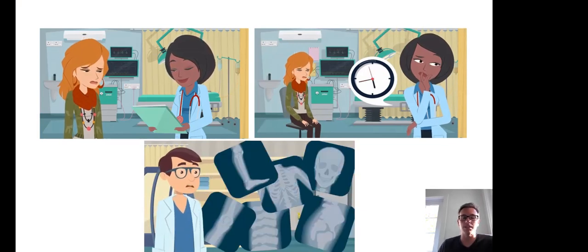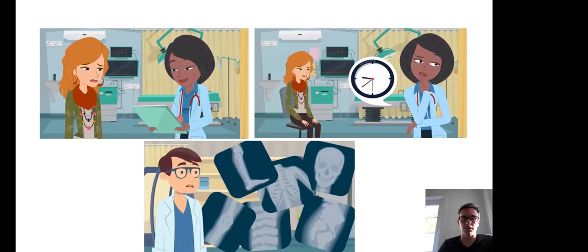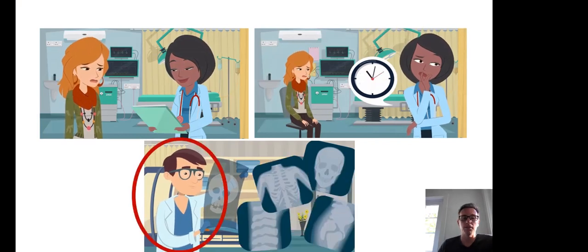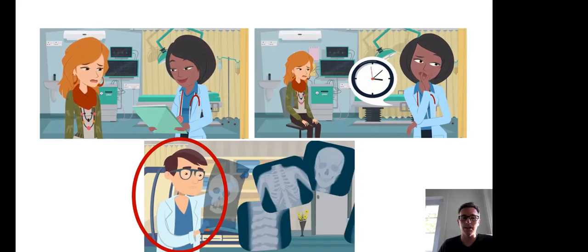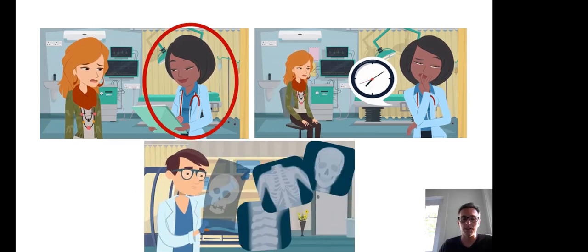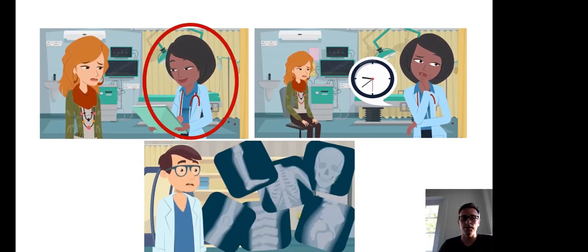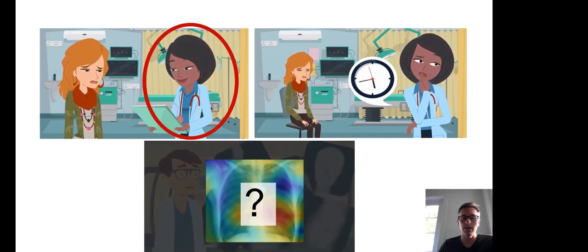So in most cases, the applications you're seeing for deployment and clinical translation for AI in radiology have focused on trying to make the radiologist more efficient, reducing the time it takes them to go through the studies. But what we've found is that there's a lot of interest from this doctor instead. This doctor could use the tools and make decisions right at the point of care if we can provide a contextually aware AI model, in this case maybe the multimodal data fusion approach, that allows both clinical context and pixel data to inform clinical decision making.